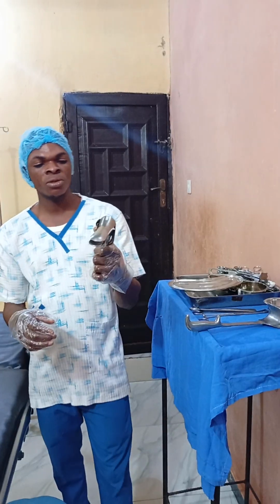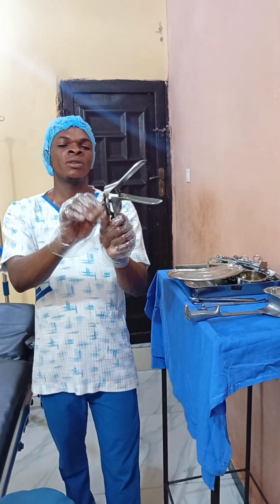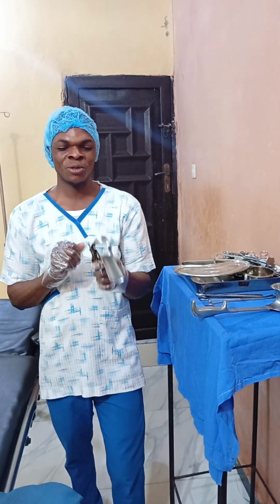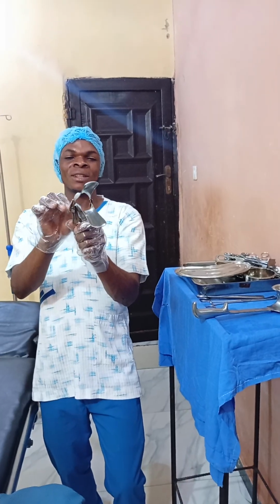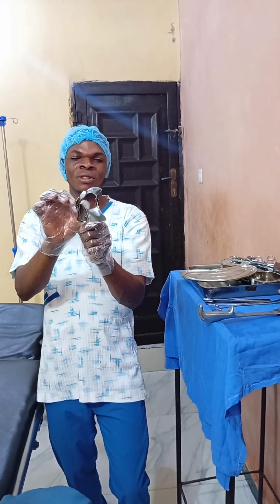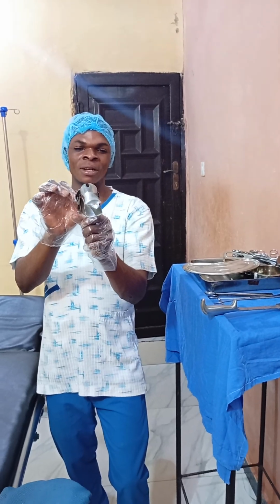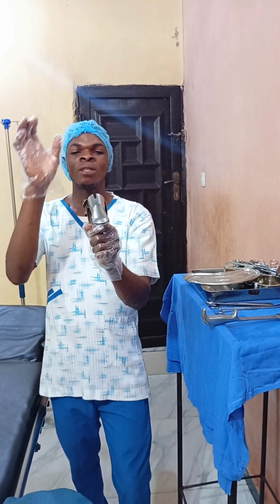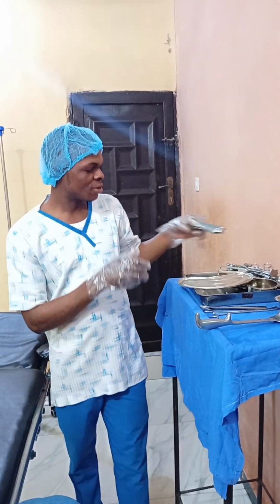Look at how it is being used. See, when you open it and tie it here, the thing will stay like that. You will be seeing everything that you want to do. So now when you finish everything you want to do, you can remove it. Just look at. The thing will close, then you bring it out. Do you understand? It's okay.